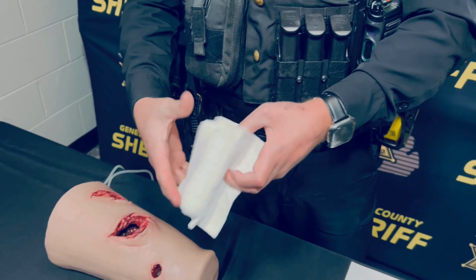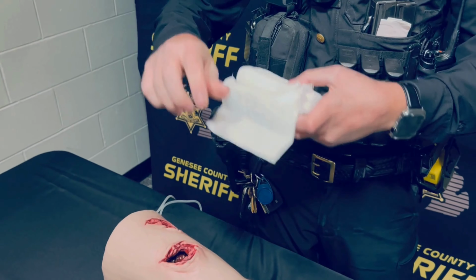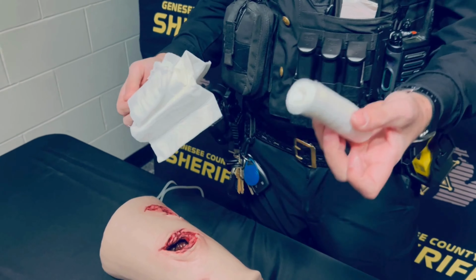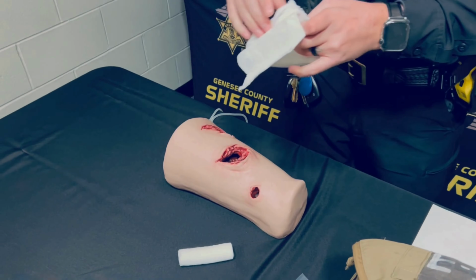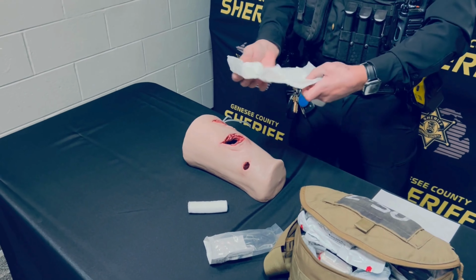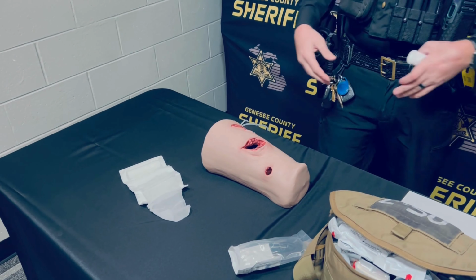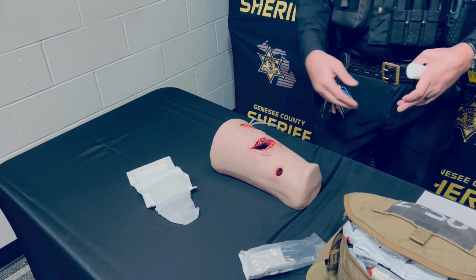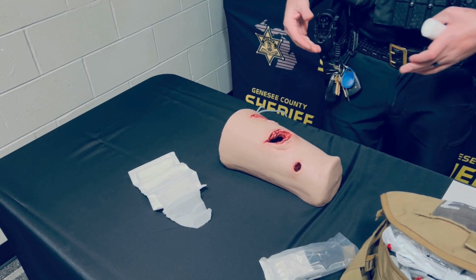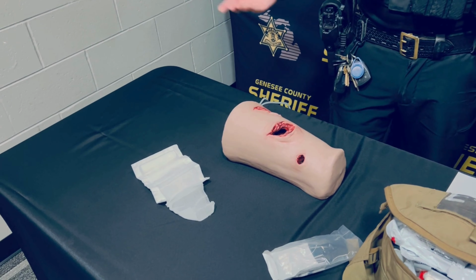As you can see, this trauma bandage has a large pad on it to absorb lots of blood, but it also has 2 rolls of gauze. One of them is independent of the other, and then this one is actually attached to our bleeding control pad here. When having to pack a wound, normally we pack junctional injuries, so that would be anywhere that you can't get a tourniquet, in the shoulder or in the groin specifically.